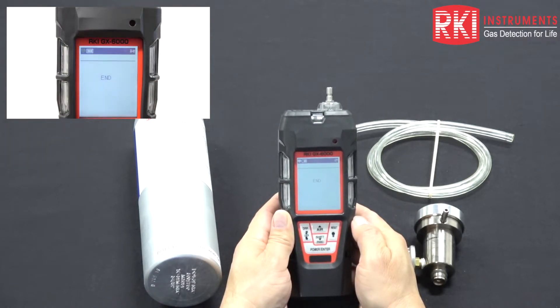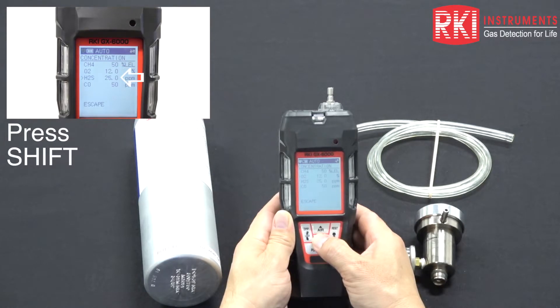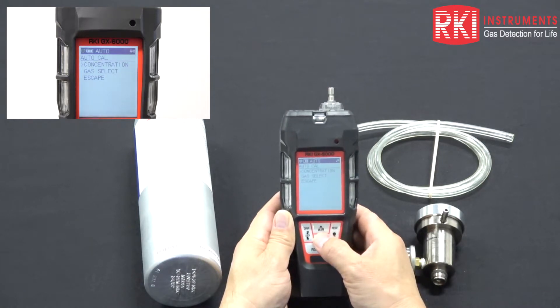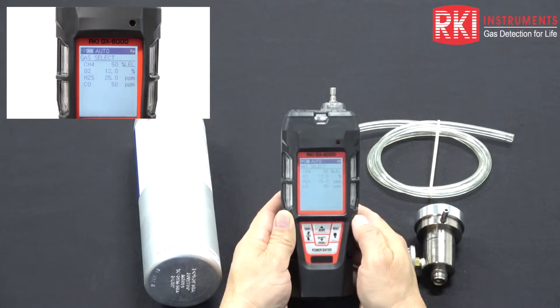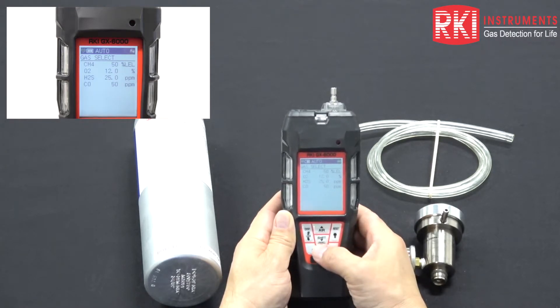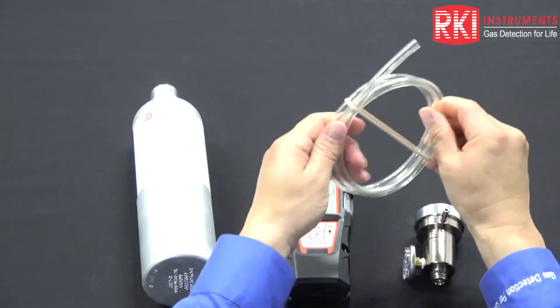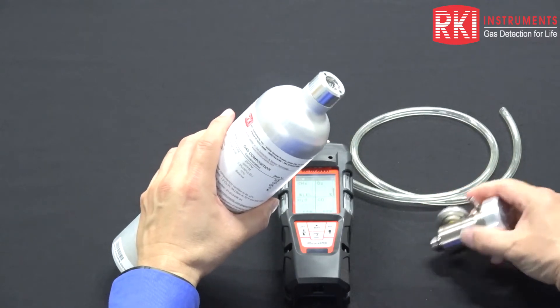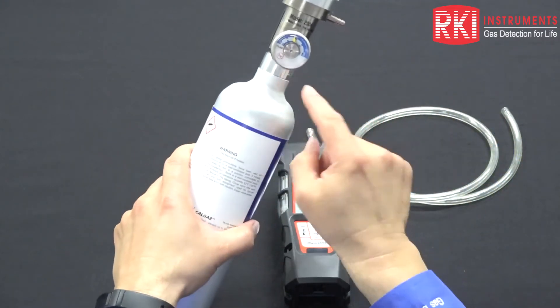You can do that for each gas if you need to change any values. Everything is in agreement with our gas cylinder. Press the down arrow to escape and press power enter to return to the auto cal menu. Then move the cursor to gas select and press power enter — it confirms the values the unit expects to see, corresponding with the label on the gas cylinder. Press power enter and it says 'apply gas' with the values flashing. Set the unit down, remove the rubber band from the cal tubing, get the cylinder, and verify there is plenty of pressure on the pressure gauge.